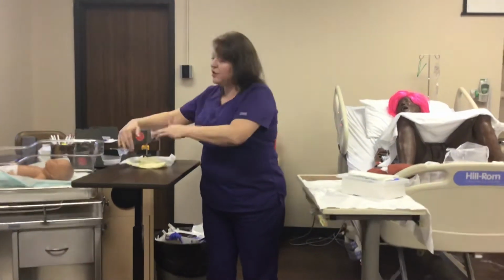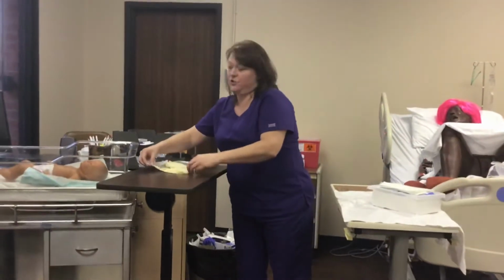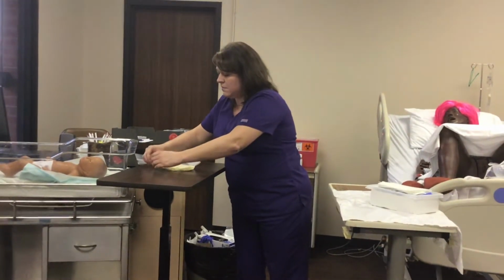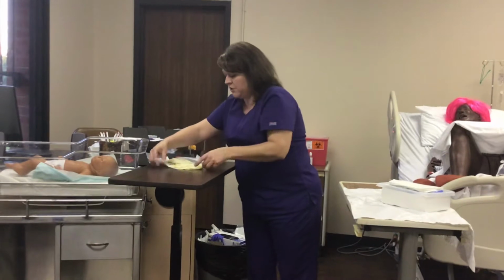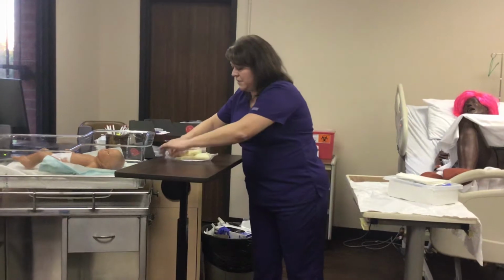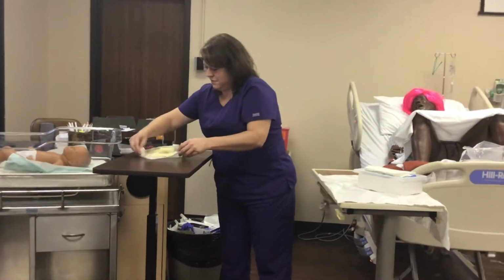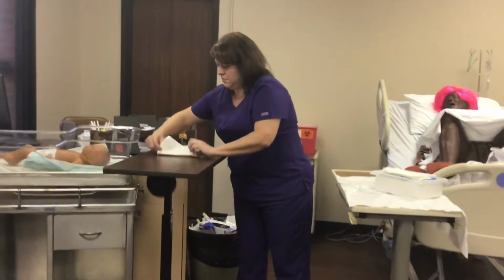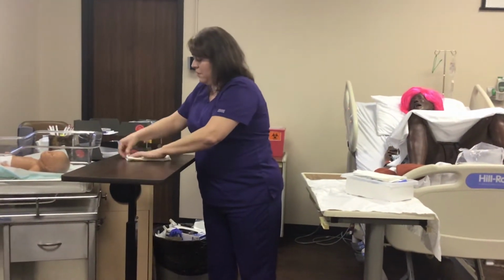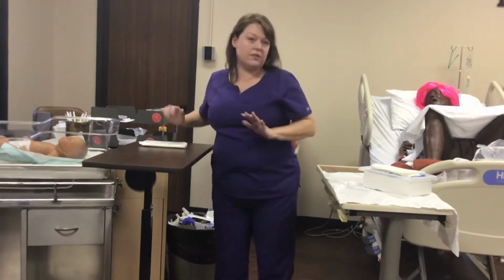I'm going to go ahead and put it back together since it fell apart because we're reusing these and we're kind of working on a time crunch. So I know that normally that would not happen. But just for the sake of time, I hope that's okay, Miss Hickman, because the security guard is waiting for us to be finished so that she can go home. And I know it's just because they've been used. We've been practicing with them. Okay, so they're back in the package and everything is back the way that it was.